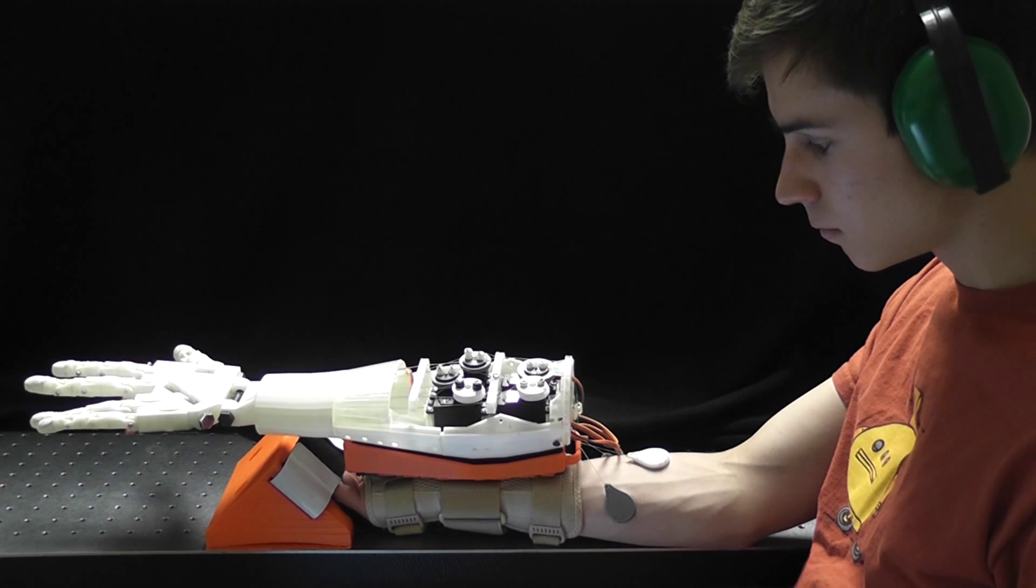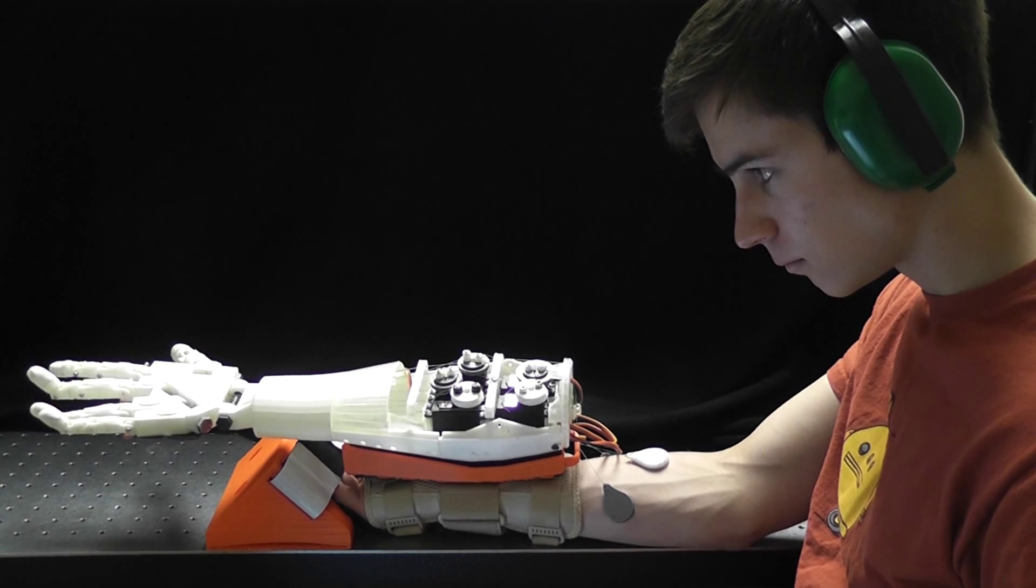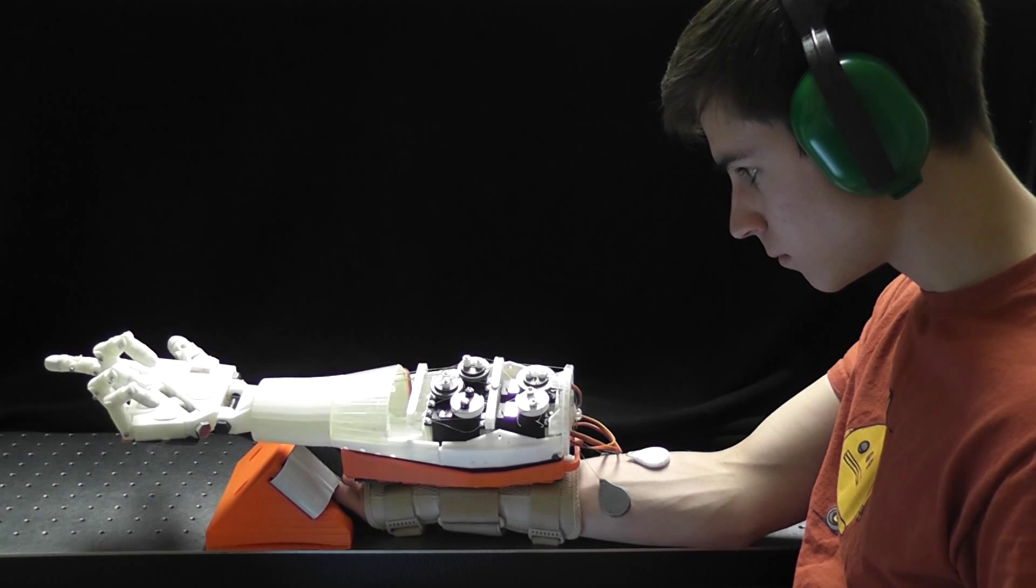Extending our device to multiple degrees of freedom, we attached two additional contact pads to the radial and ulnar sides of the forearm, corresponding to the thumb and middle finger joint angles, respectively.